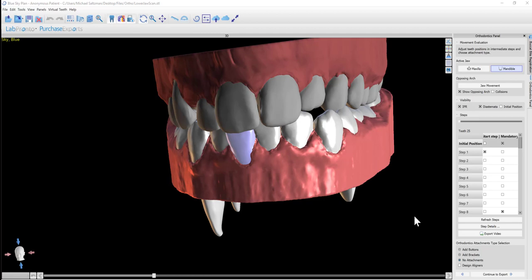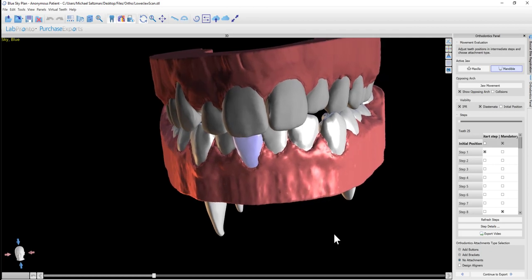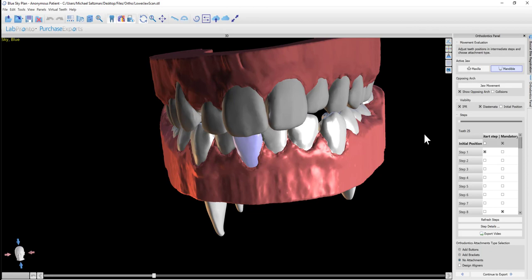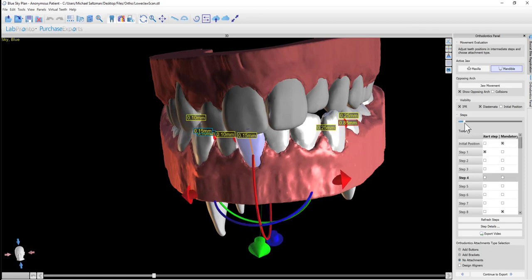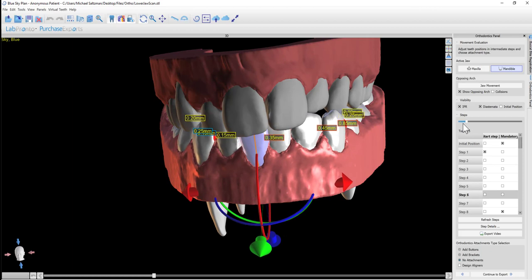Now we have the ability to modify the computation that the software did when creating the steps. Let's say in a situation where you see that as you go through the steps, the IPR increases or the teeth collide and you want to rectify that. So you have a couple different ways of doing that. First of all, at any given step, you could go ahead and click on a tooth, you can activate it, and you can move it.